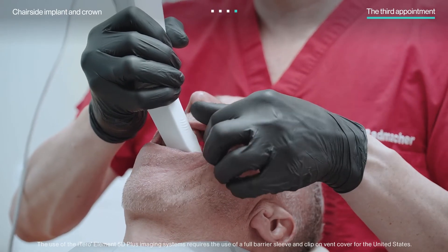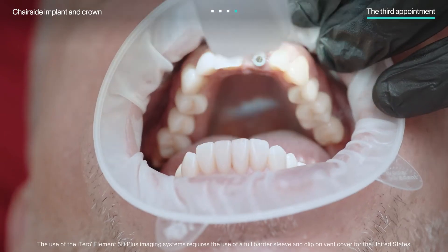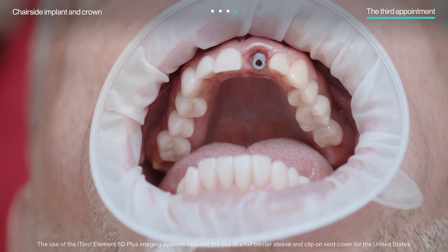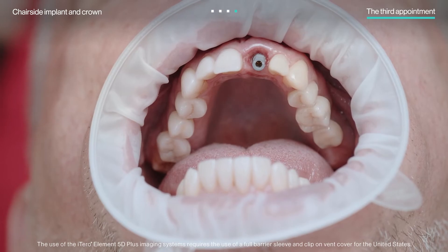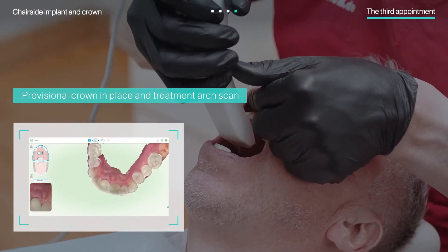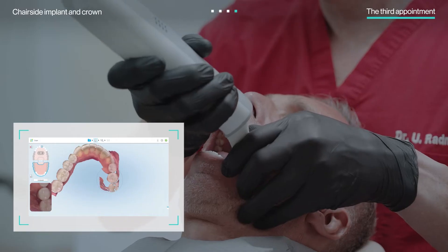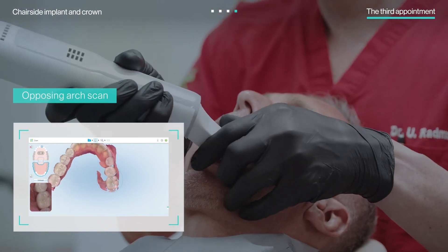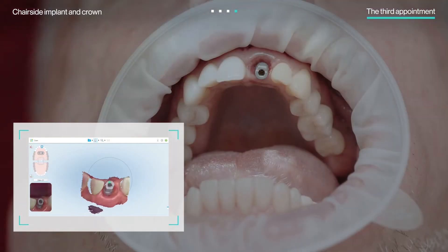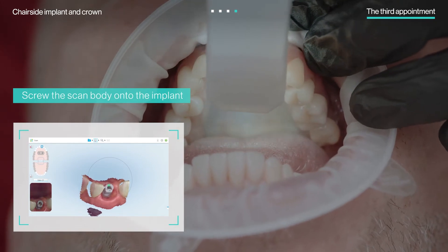Once he was healed, the patient returned for final scanning. Dr. Radmacher first checked for successful osseointegration, as well as soft tissue health and contour, before proceeding to the scanning protocol. First, he scanned the arch with the provisional crown in place to record the adjusted occlusion and capture the crown contour. Secondly, he scanned the opposing arch and the bite. Then, the scan body was screwed onto the implant and scanned individually and within the arch.